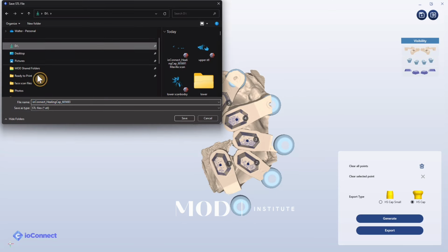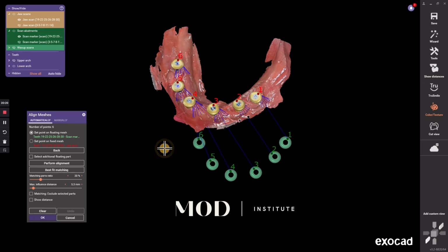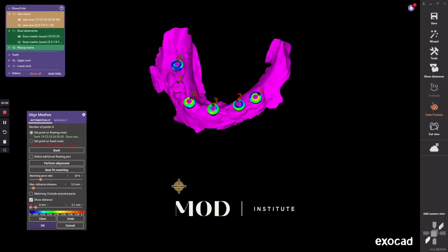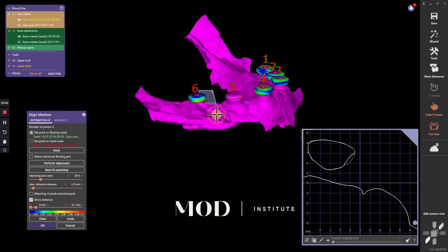And so you do not need a soft tissue scan to align with this, because you're going to actually just align these exported caps to the soft tissue scan in exocad. So here in exocad, I'm aligning the scan body from ioConnect software to my soft tissue scan, and we see this huge discrepancy here on this site number 28.